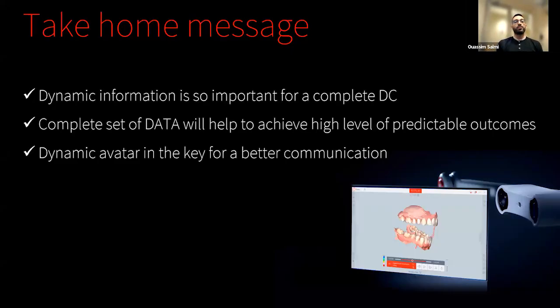So this is what I wanted to share with you today according to 4D dentistry. I just want to finish by saying dynamic information is so important for a complete diagnosis and treatment planning, because static is good, but once you need to change something, you need the dynamic. It's so important to have a complete set of data, and what I mean with that is static and dynamic, at least an intraoral scanner and Modjaw, will help to achieve a high level of predictable outcomes.